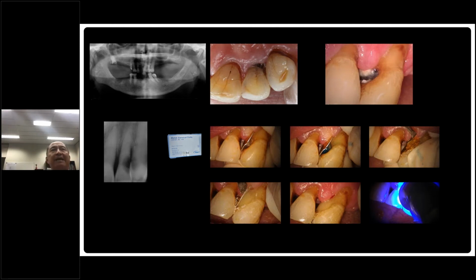Well, glass ionomer cement is an acid-base reaction. That means when you first mix it, it's an acidic material. And therefore, the bonding between the glass ionomer cement and the tooth is quite different from resin bonding, where you have an intertwining of the resin into the hybrid zone to form the seal. The glass ionomer cement forms a chemical hybrid zone, which I will show to you now.